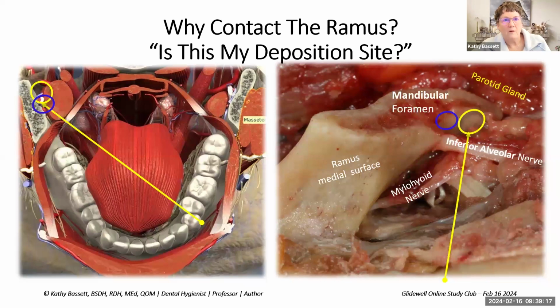And what I really propose on this is that our intention to do this is really about safety. So if the yellow lines are traditional angles, then the blue lines, this is where you end up when you swing the barrel too anteriorly. Maybe you have somebody with a really narrow face, or you've made premature contact and you're trying to adjust around it. But then what ends up happening if you don't come back is you essentially just go right out the back door, and immediately behind you is that mass of parotid tissue with the facial nerve moving through it.